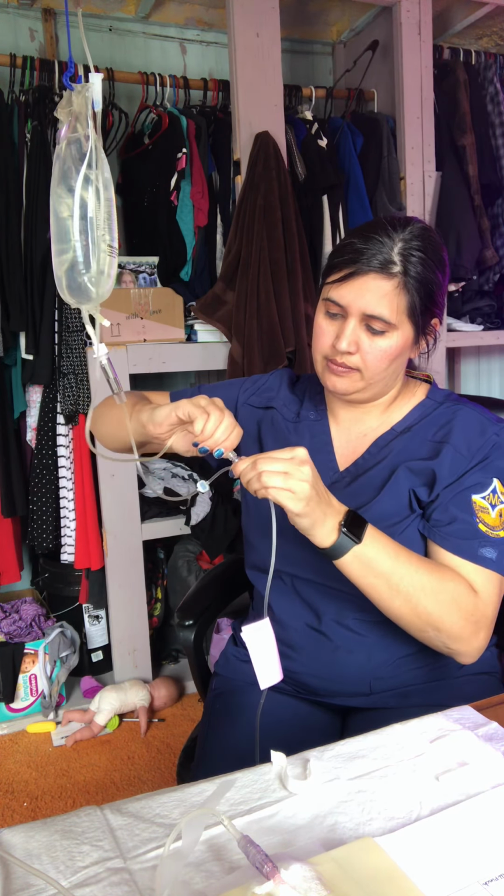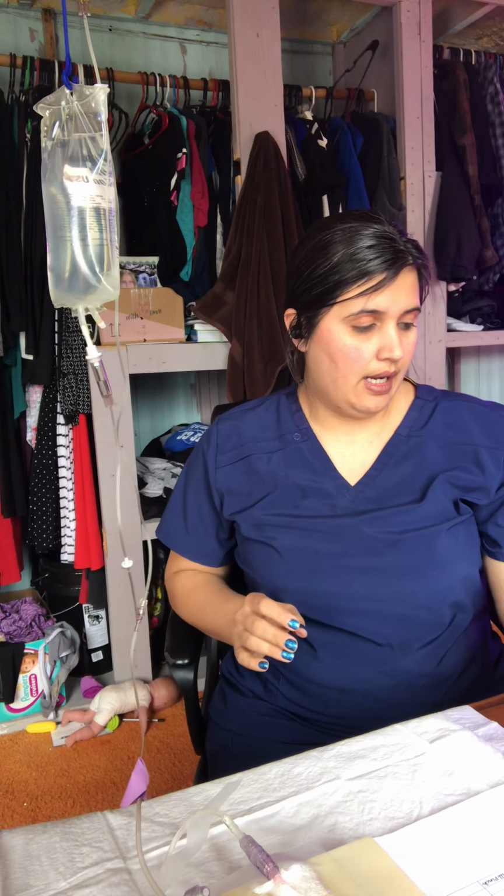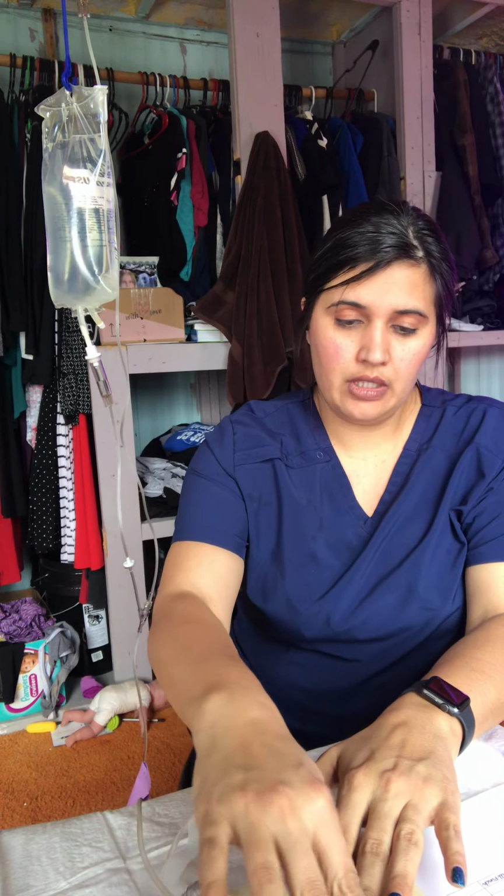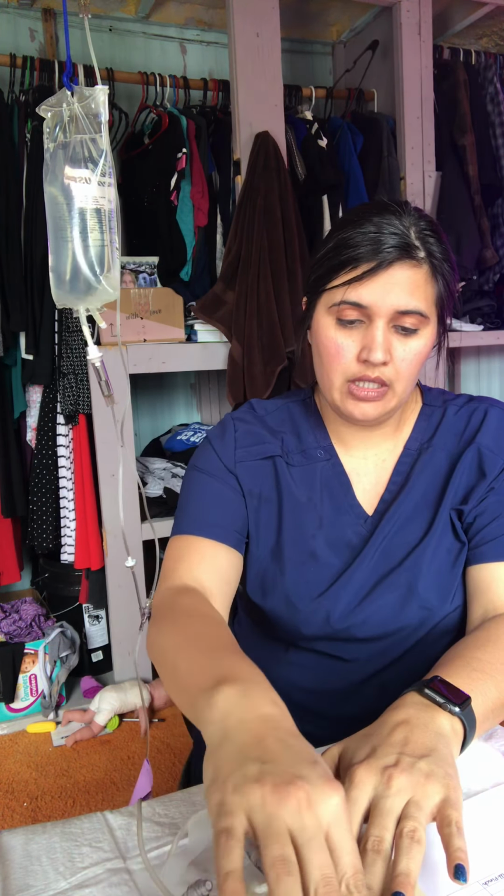Make sure the patient is doing well. Check for any signs of infiltration around the catheter site.